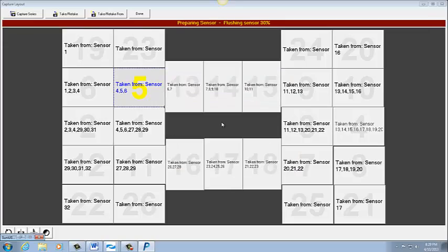and click OK. And then if you look up here in the toolbar, it's red, Sensor ready, and it just turned green. And I don't know if you heard that little voice, but there's a female voice that'll tell you the sensor is ready. That means the sensor is ready to be exposed. Now, if you get it all ready and the toolbar is green, and then you get your XCP ready and you're talking to your patient, after about a minute or two, this will become unready and it won't be green anymore. So you need to make sure before you expose your image that this toolbar is still green and it still says sensor ready. Otherwise, you'll expose your patient for no reason and you'll have to take it again.